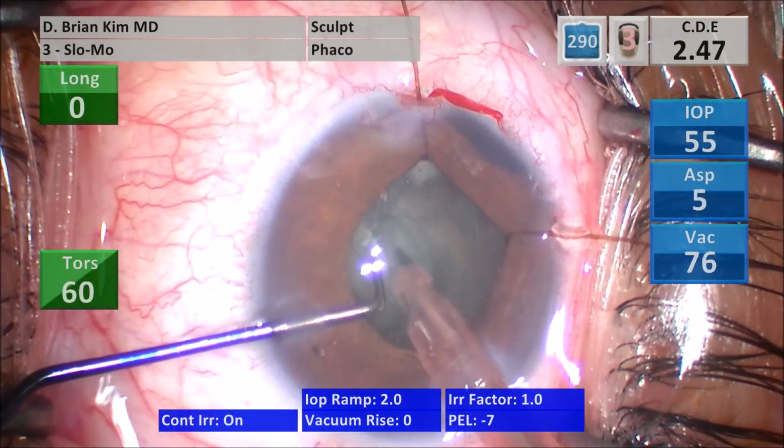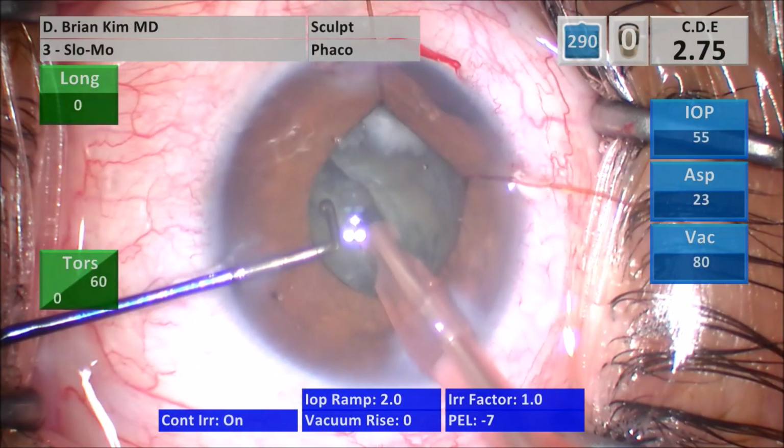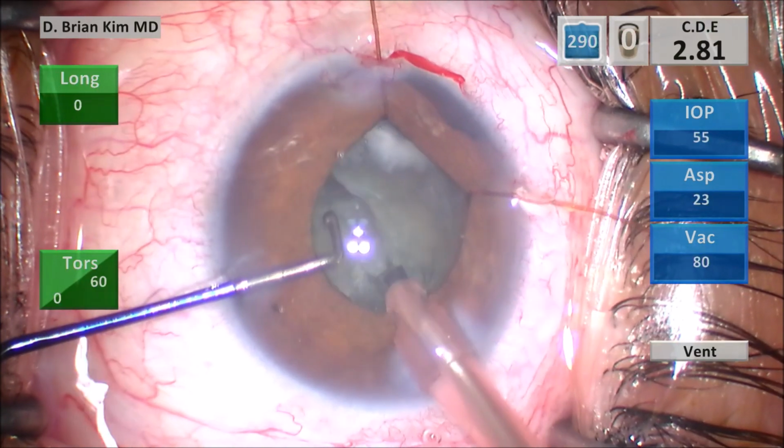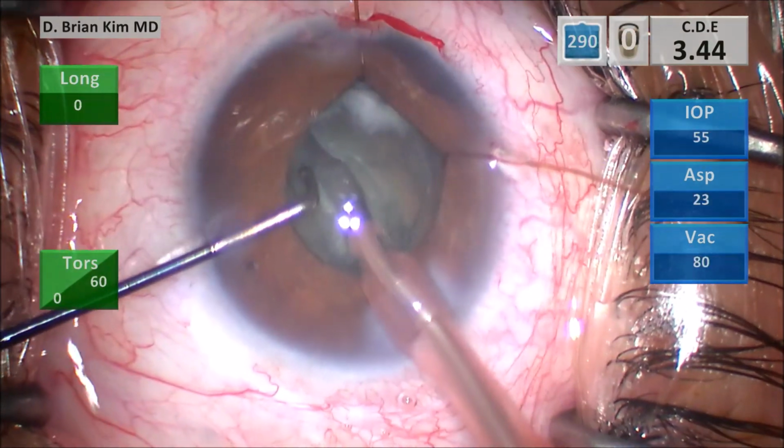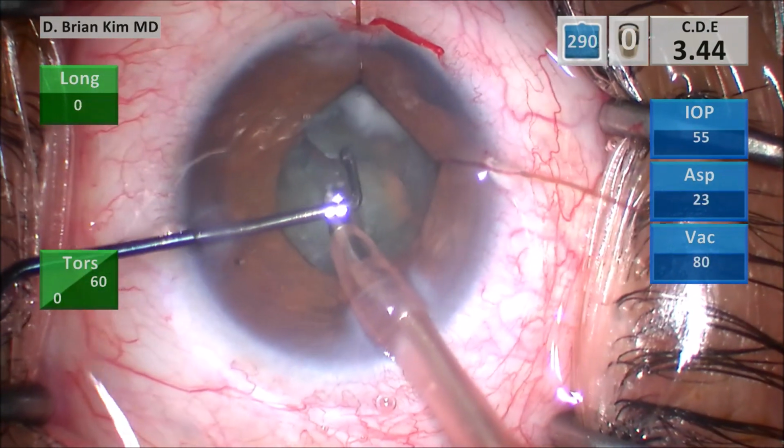Yeah, so you notice I was actually in quad mode, and so I switched to sculpt mode, but as I did that, the IOP went back up. So I had to go ahead and switch. So we went back to the quad mode now.